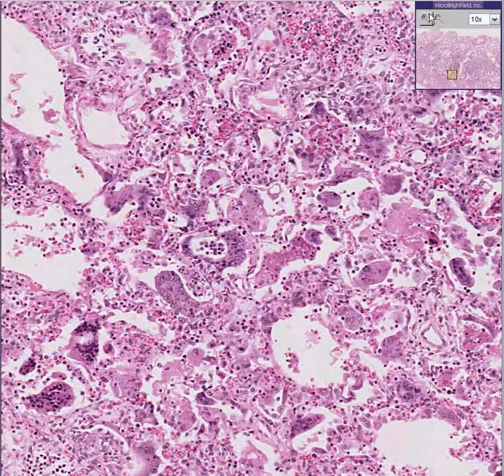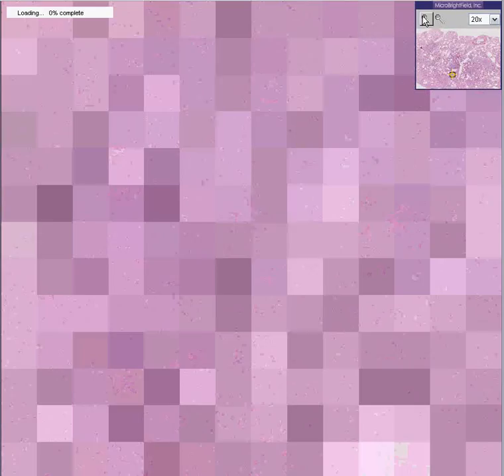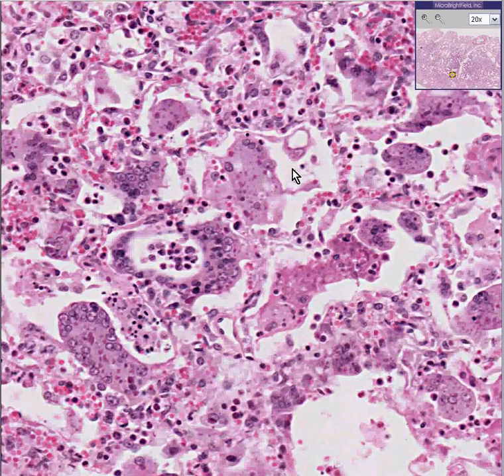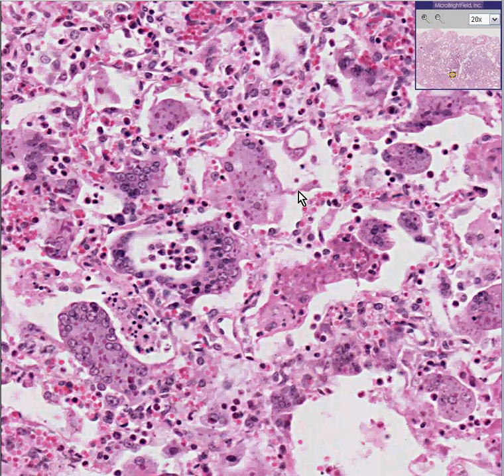And the type of pneumonia which causes numerous giant cells is measles. This is measles pneumonia.